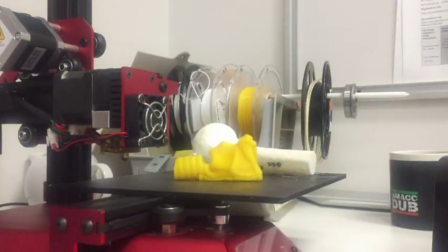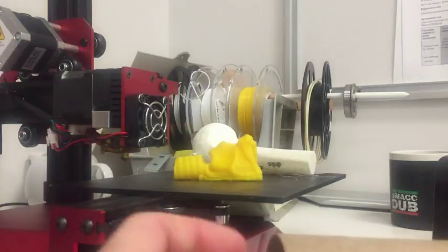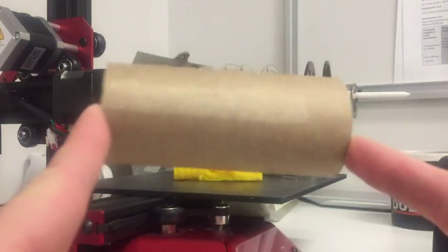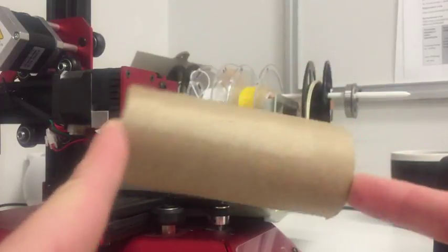But not everybody has a 3D printer or is able to access one. And just for fun, this is a part task trainer that I had a look at previously when I was starting up in 3D printing, and just off the bat for fun, I'd made one out of a cardboard roll, which is something that everybody does have access to.